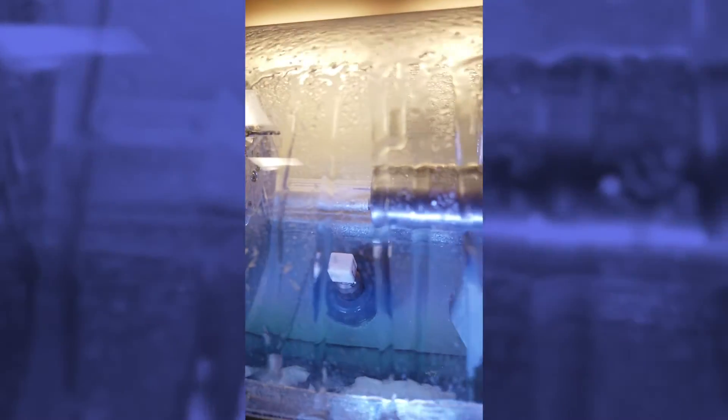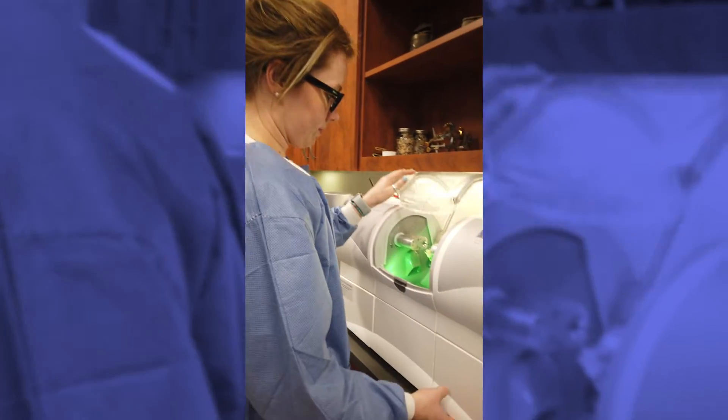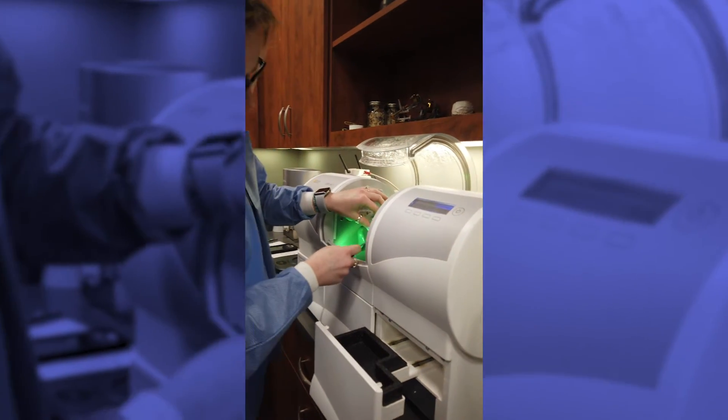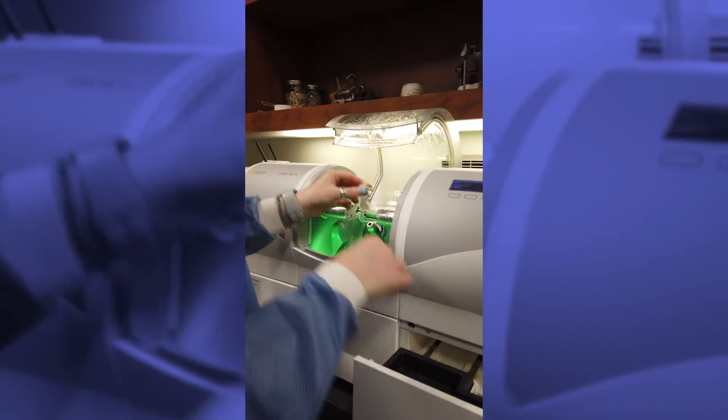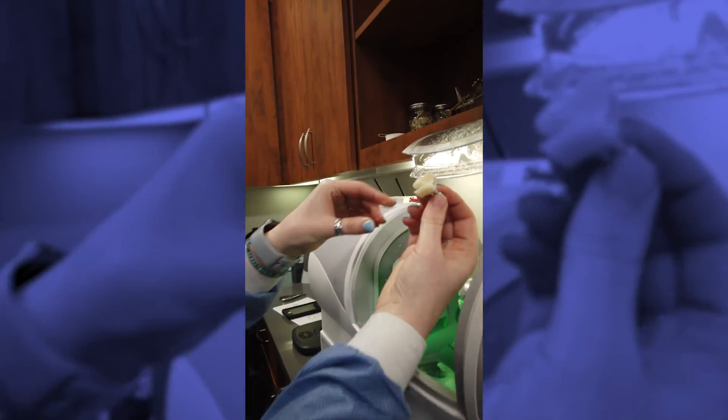We're gonna take that whole block out of there. So we will take this out, and there's the little tooth on the block.